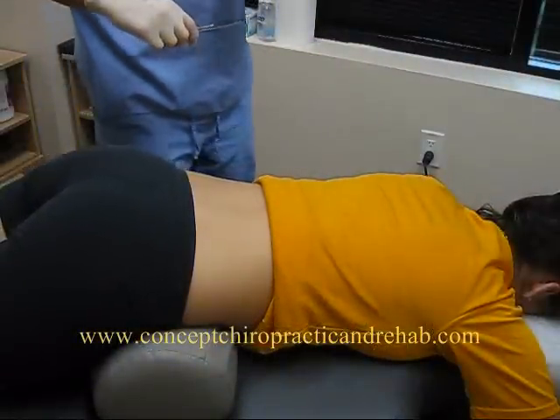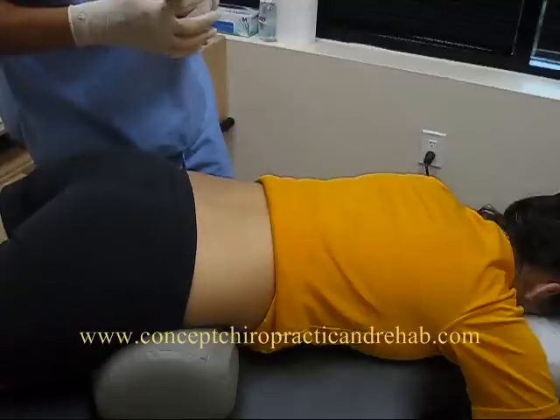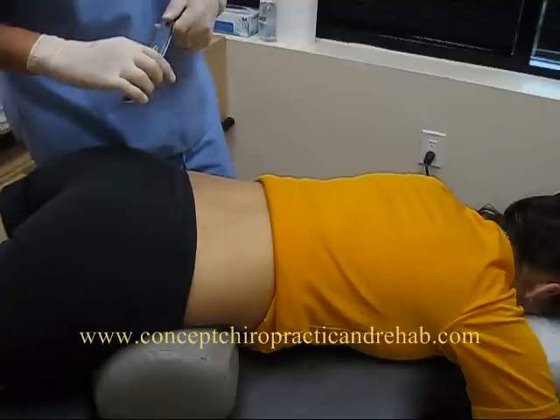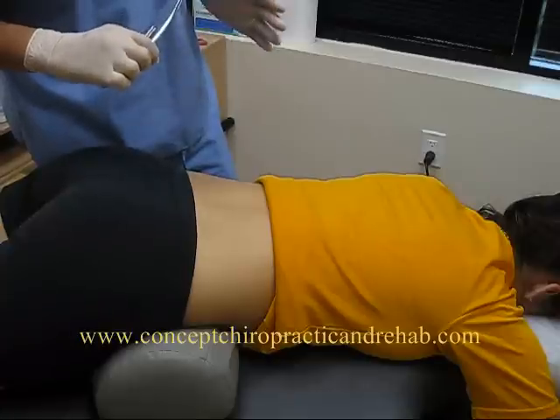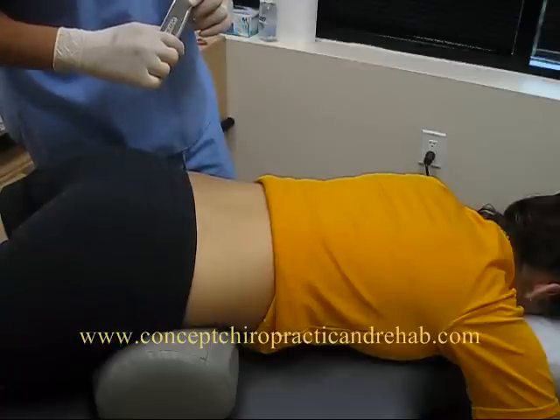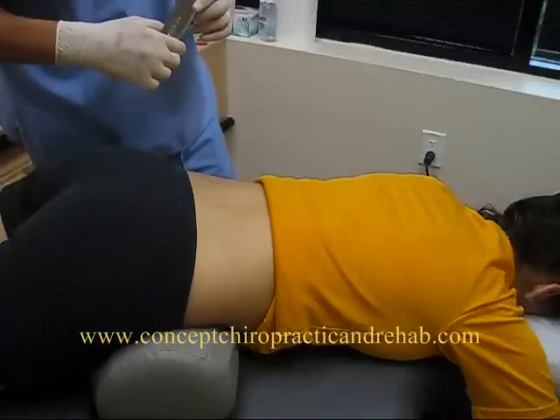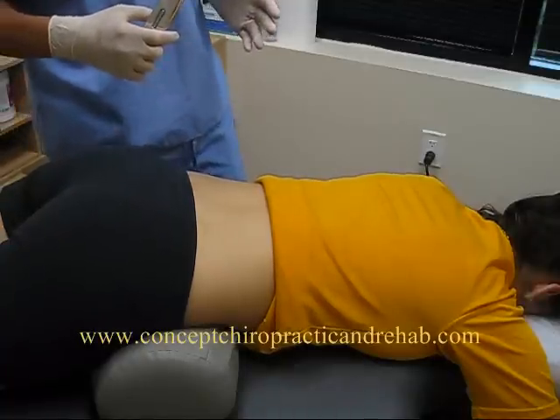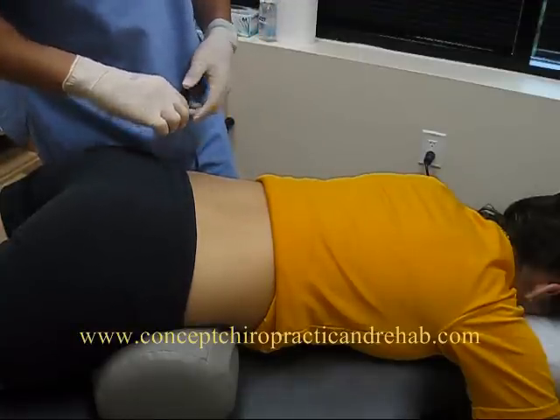Hello everyone, like I said, we're going to demonstrate the low back pain treatment called the Graston technique for low back pain. I just want you to remember that the Graston technique is not just for low back pain. It's a really great technique for a lot of other joints in the body, like the shoulder and the neck and the knee, and specifically for a lot of athletic injuries like sprained ankles and sprained knees and things like that. But specifically what I'm going to demonstrate today, it's why it's really helpful for the low back.